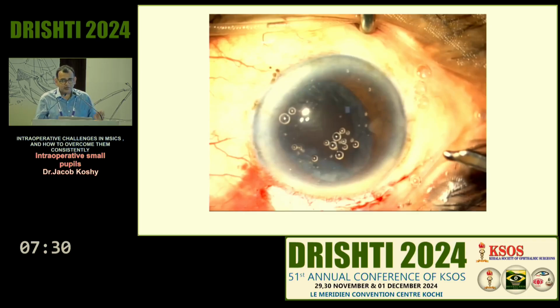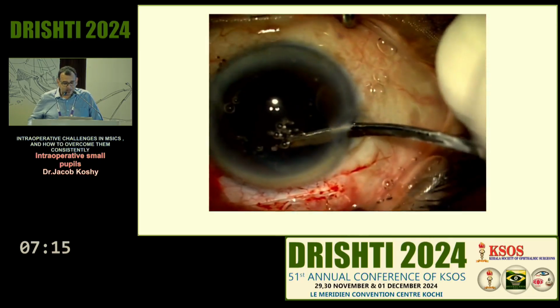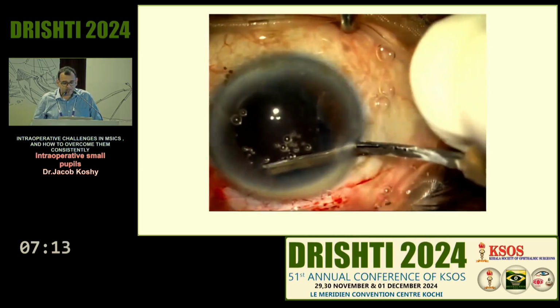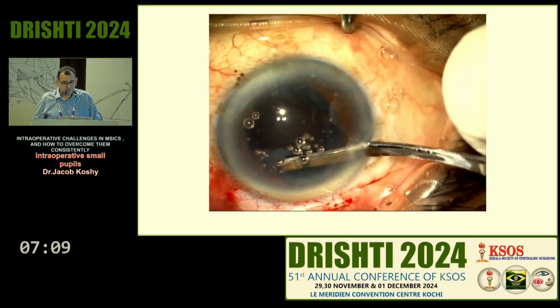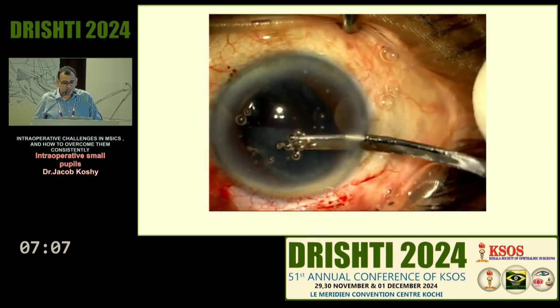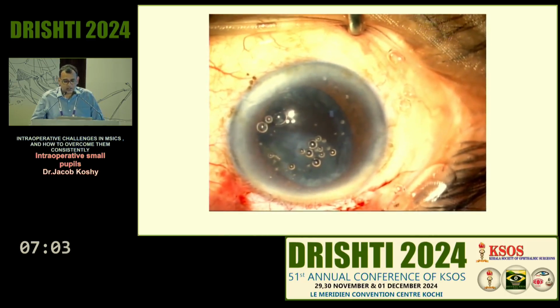And then sometimes you have these cases which, when you have the problem, you start wondering why you became a doctor, or why you took ophthalmology, and sometimes you start wondering why you were even born, those kind of things. And you're doing the case, and then half the nucleus has gone into the vitreous, and you're just trying to see what's happening there, and you see that the nucleus is floating in the mid-vitreous cavity, and you're desperate.